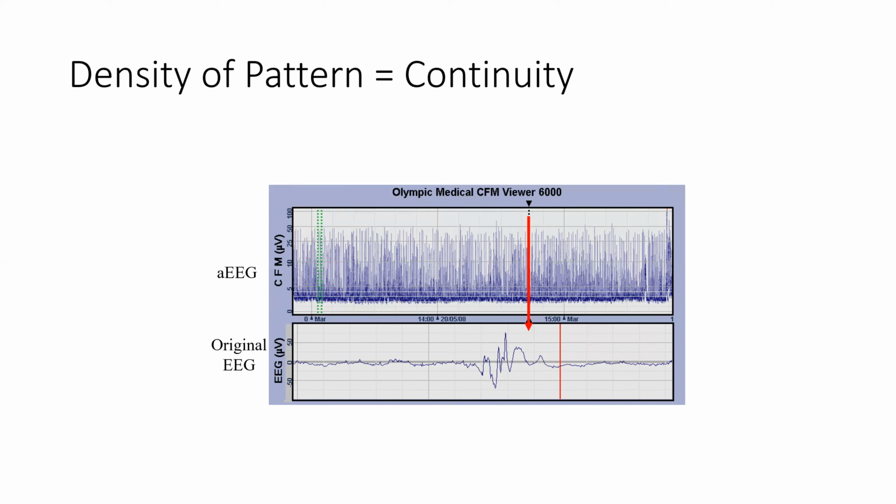And so I'm going to use burst suppression to help illustrate this because I think that it does it the best. Let's look at the EEG first. At the EEG you have here, you have this suppressed activity and then a burst. So again, you have this mixing of voltages, which cause you to have a rather low bottom margin and a rather high upper margin. And what we see with this, when there are more than 15-second gaps in bursts, we have blank space. So the density of the pattern reflects how continuous the activity is.